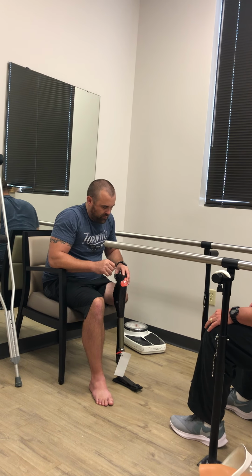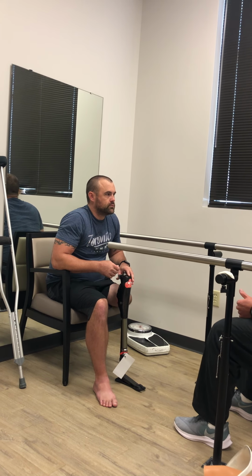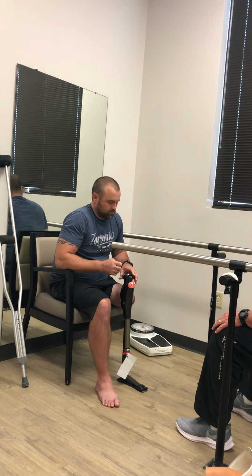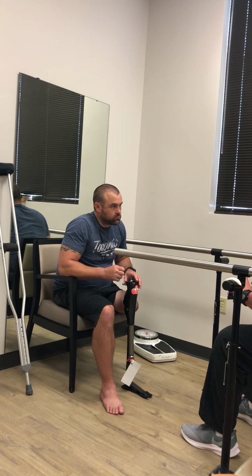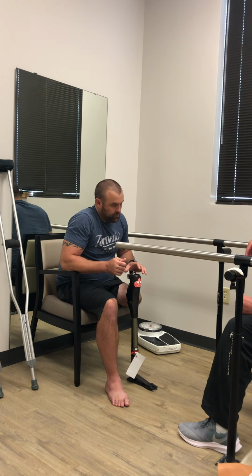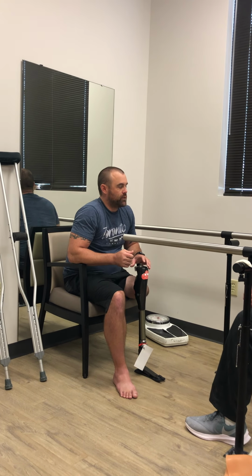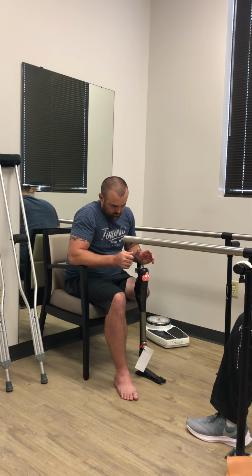So sometimes it comes down to function versus, I hate to say it, cosmetics. As long as I've got your body height right, it won't matter. Some people say, I don't care, I've got all the cool stuff that helps me. So it just comes down to that.